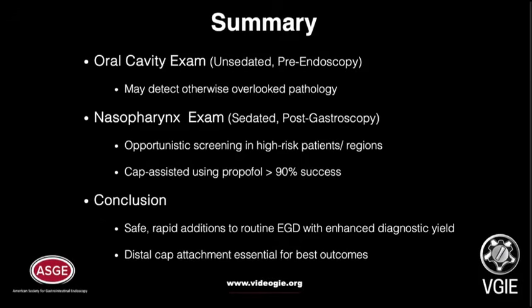In conclusion, oral cavity and nasopharynx examination are safe and rapid additions to routine gastroscopy with enhanced diagnostic yield, and the distal cap attachment is essential for best outcomes.